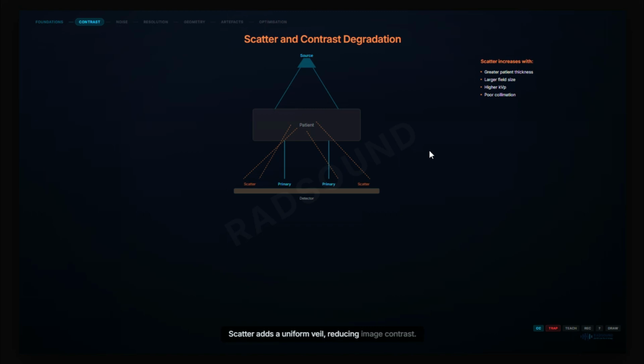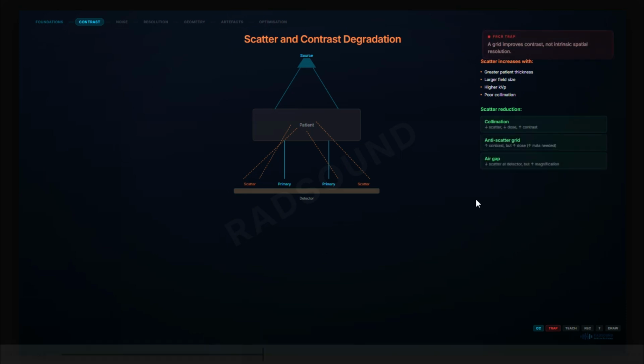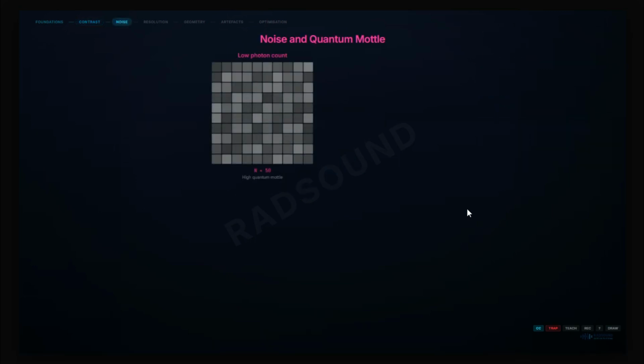Poor collimation also increases scatter: if you are capturing only a small part of the body but didn't collimate well, scatter increases. So poor collimation, size of the body, thickness of the body, and high kVp are among the factors increasing scatter. The methods I also mentioned, such as collimation and air gap, are among the things we employ to minimize scatter from reaching the detector.